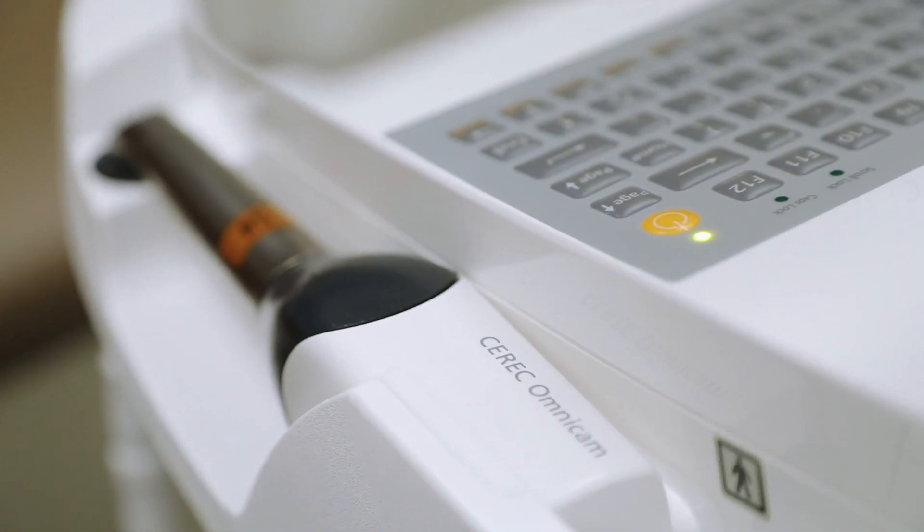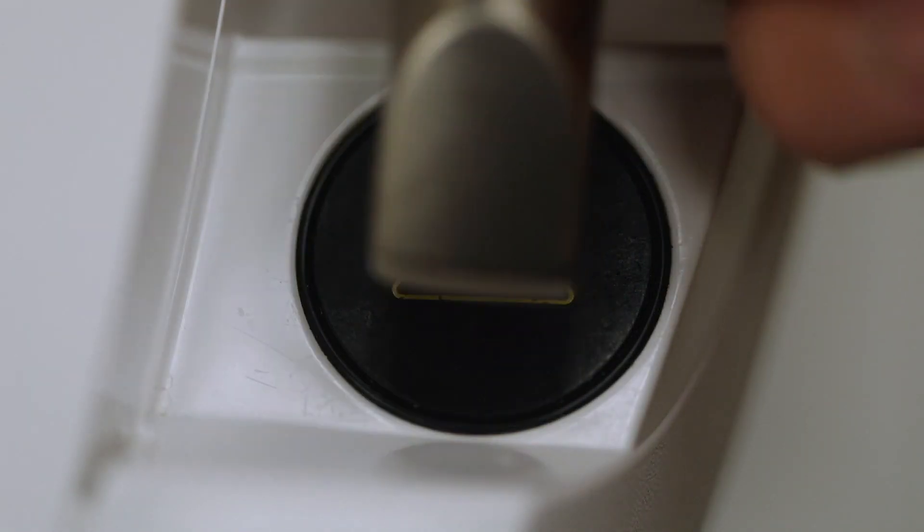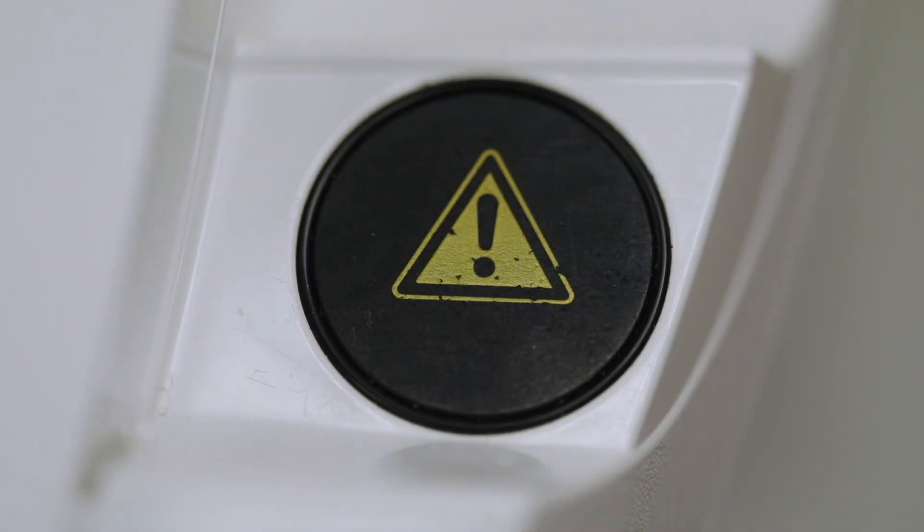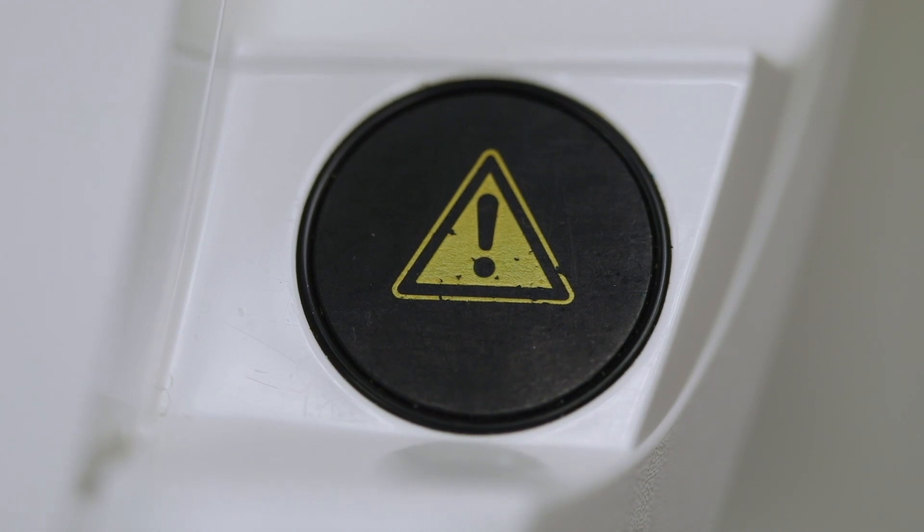This heating element will warm up the lens inside the camera and help to minimize fogging when in use. Sirona recommends that before you use this machine on a patient, you turn the machine on and let it warm up the lens for about 15 minutes prior to use.